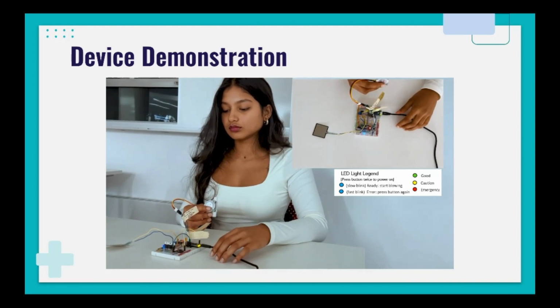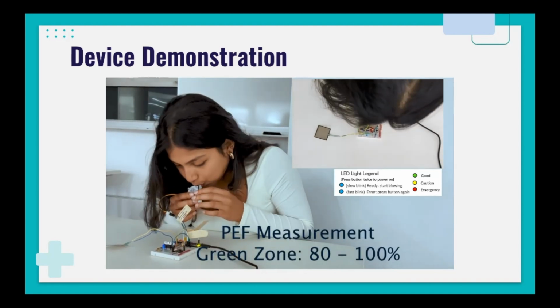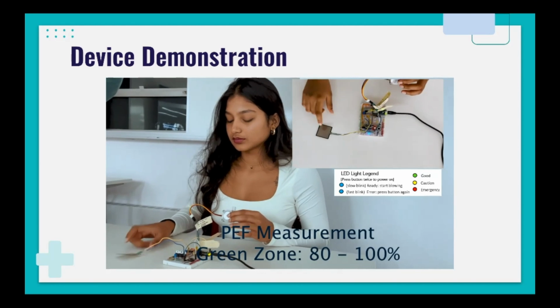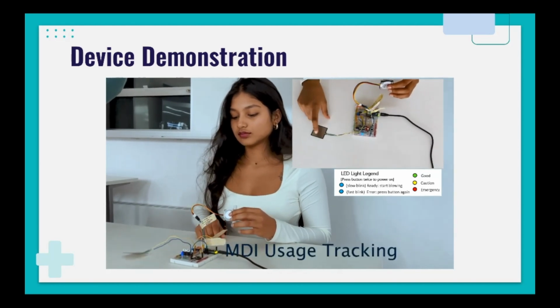And towards the end of the video, you will see that I will be applying pressure on the pressure sensor, and this will be used for medication tracking purposes and indicated by the yellow LED light.